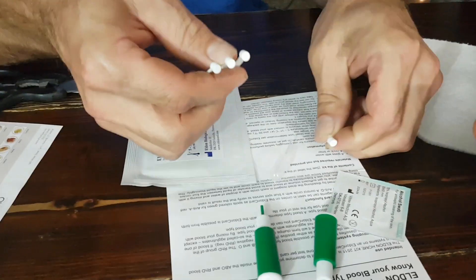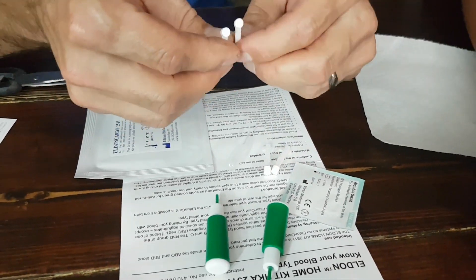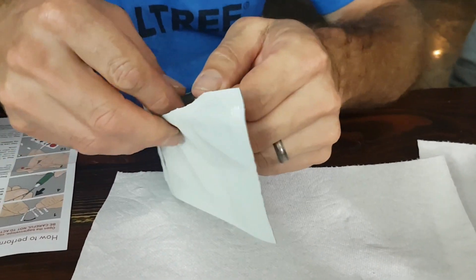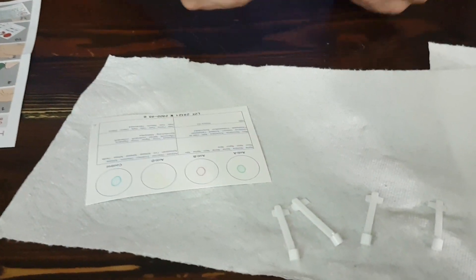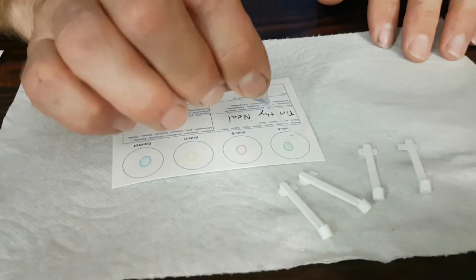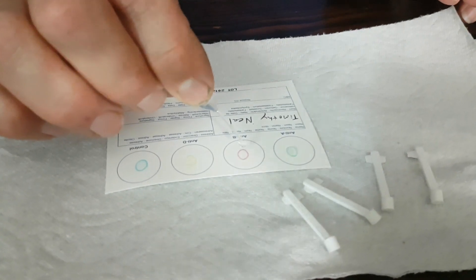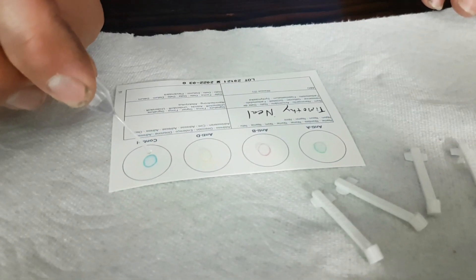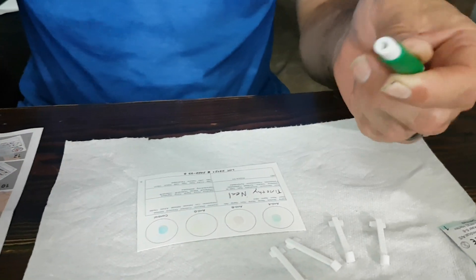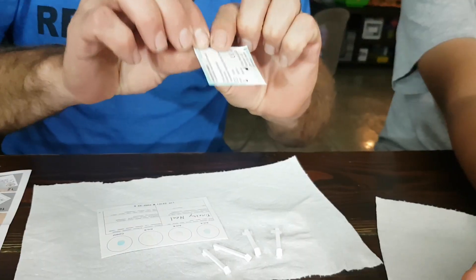Timothy has volunteered to be our first patient. The first step is to separate out all these sticks — each one will go to one circle. Then get the test card out. Step two is to put a drop of water on each of the circles; you have to be very careful not to put too much and mix the circles — these are the testing compounds. These are the finger lancets. You have to twist and remove this to get it ready to use. Next is sterilization — they send a little alcohol swab.